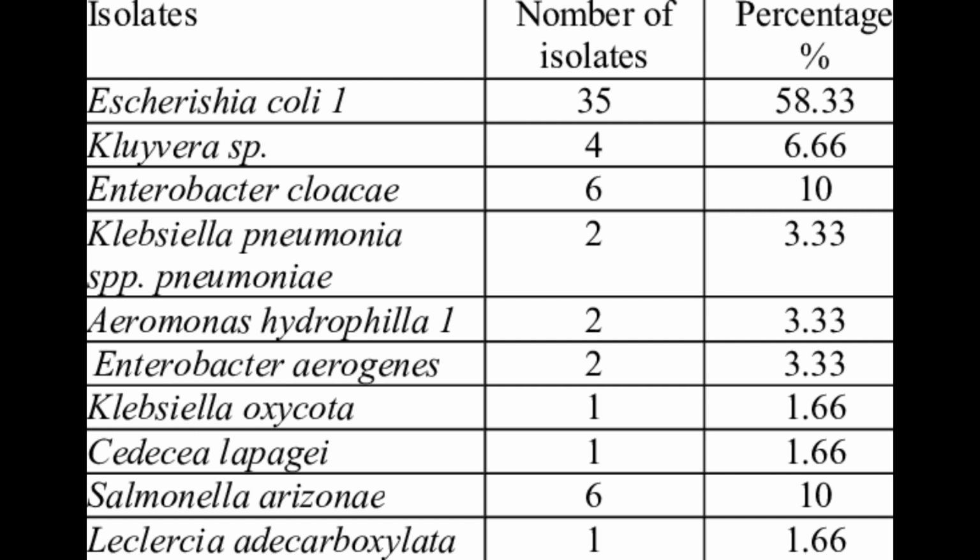Now, let's start with the review of the Mahon. Use of lysine iron agar is for detection of lysine deamination and lysine decarboxylation, and also H2S production, but results are variable. The composition includes glucose and lysine. The slant is where the deamination happens, aerobic. The pH indicator is bromcresol purple. The butt is where the decarboxylation happens, anaerobic. The H2S indicator is ferric ammonium citrate, and the alkaline product is cadaverine.